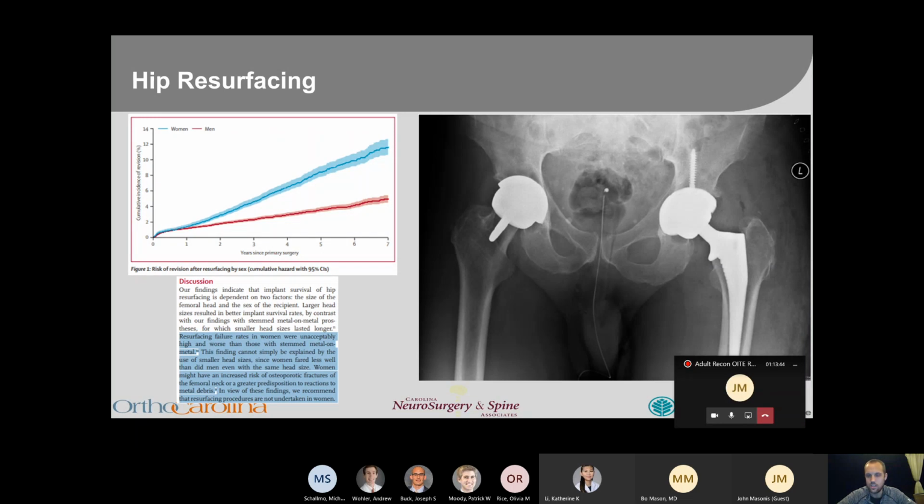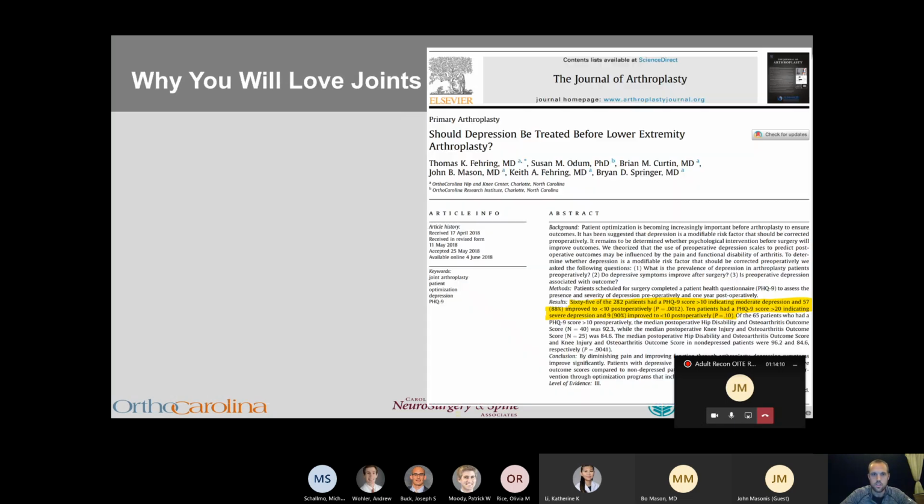And then it also has a not fully hemispherical shell. If you look at the hip resurfacing there compared to the total hip, you can see that it's not a full hemisphere. It's just a portion of one. The only other thing that I think is likely to be tested about them is the major complication is a femoral neck fracture, kind of around the base of it.